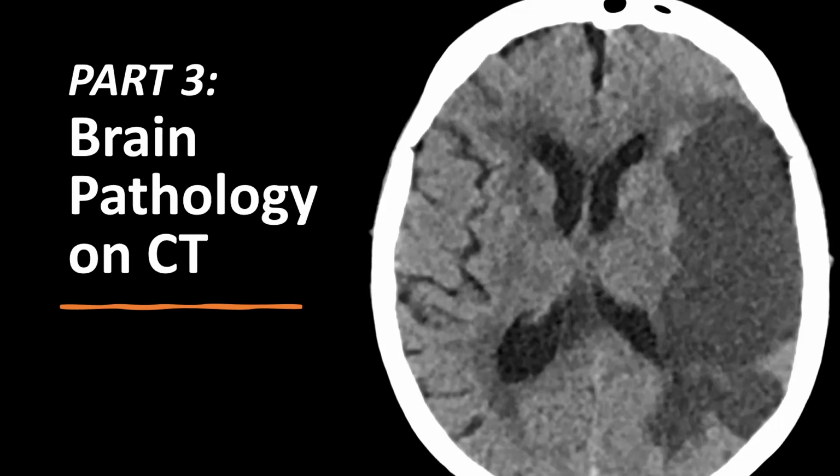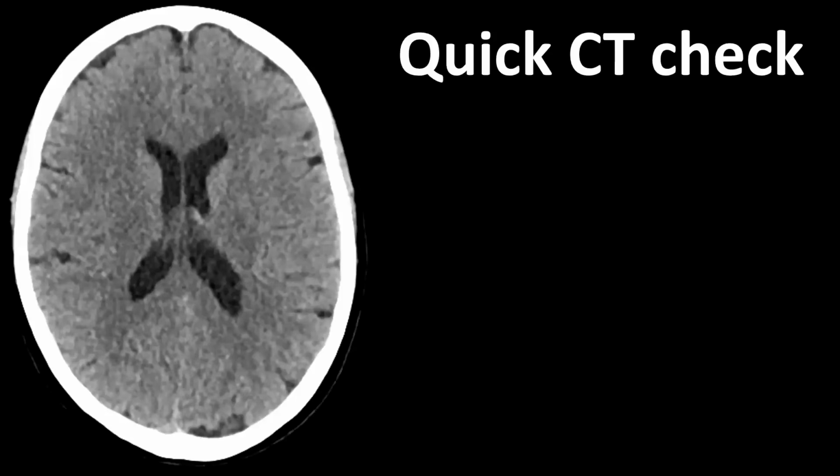Of course, I'm not going to talk about every pathological entity out there, but the most common ones, or the most frequently asked ones from your referring physicians. Needless to say, CT is often the first examination performed in trauma patients or in patients with acute neurological symptoms, so the emphasis will be on that kind of pathology.